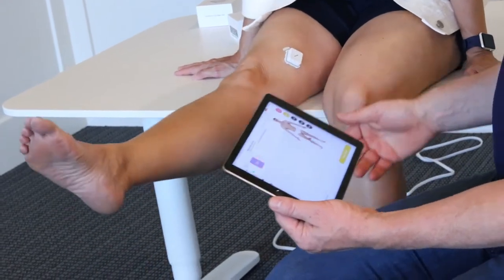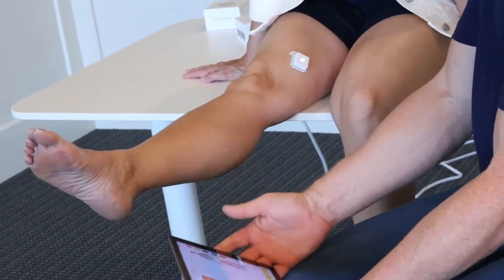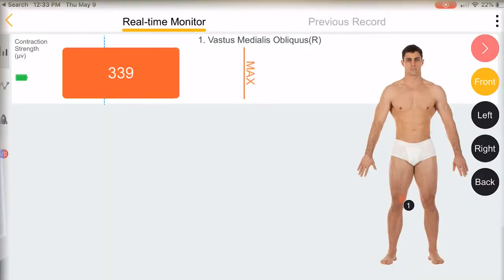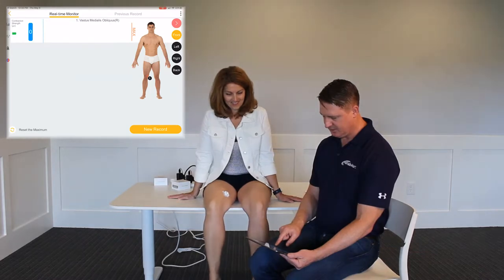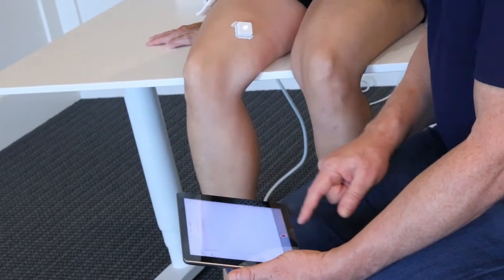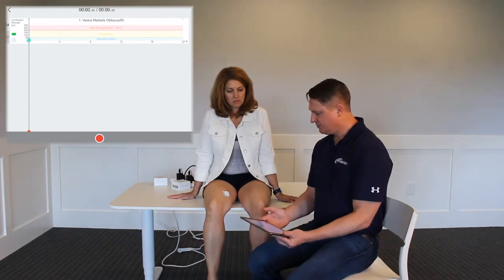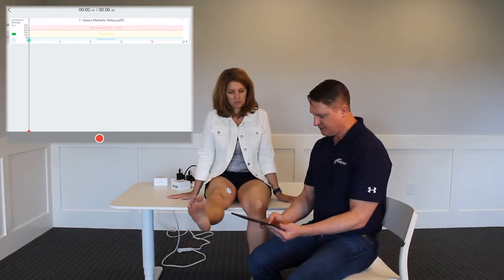Megan, if you can extend the knee and contract. You can see right now that she's contracting anywhere between 200 and 500 microvolts. We're going to do a new record — a data only record — and when I click the red button, the session will start. So Megan, if you'll go ahead and begin the contraction.